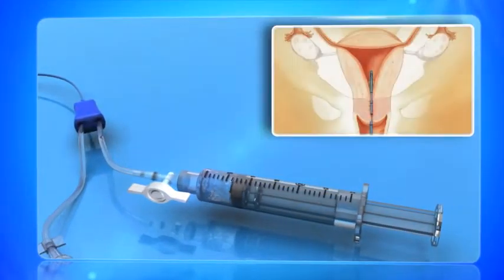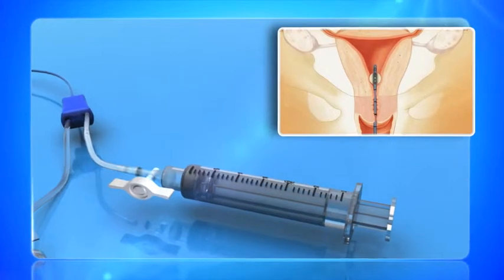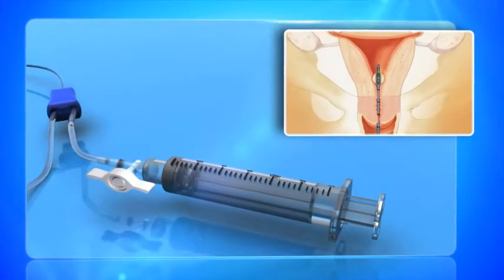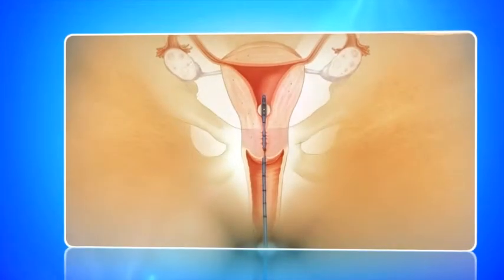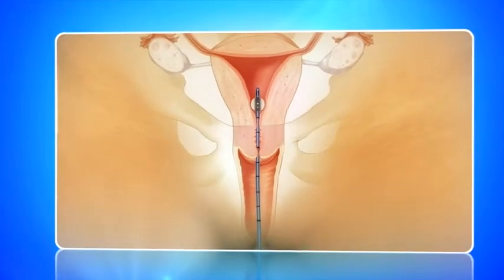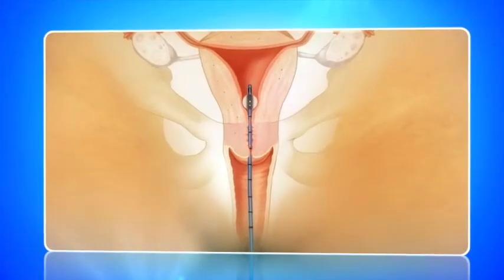Gradually inflate the balloon with 1 milliliter of saline solution. Close the stopcock to maintain balloon inflation. Pull back gently on the catheter shaft to seat the balloon against and seal the internal cervical os.